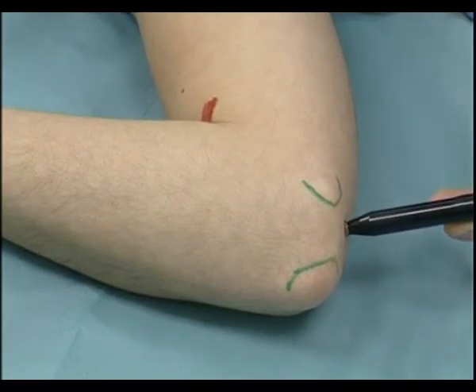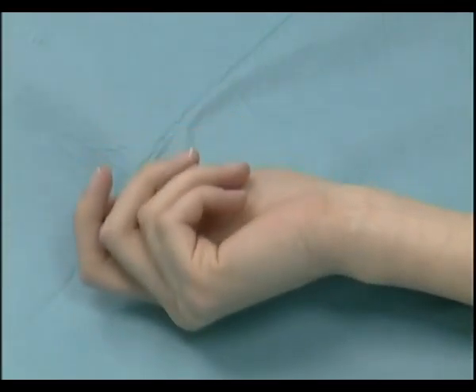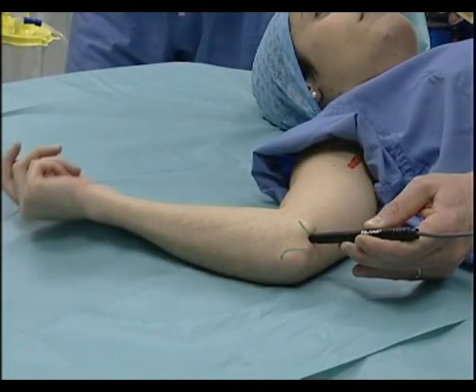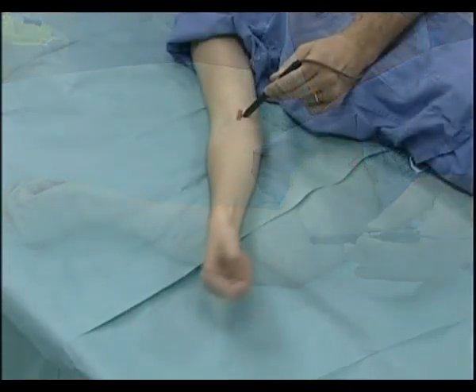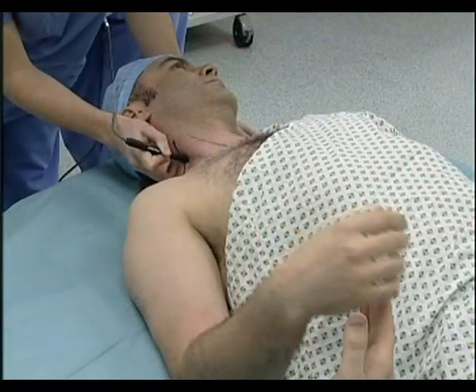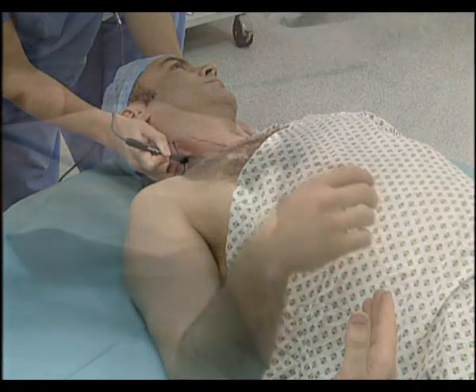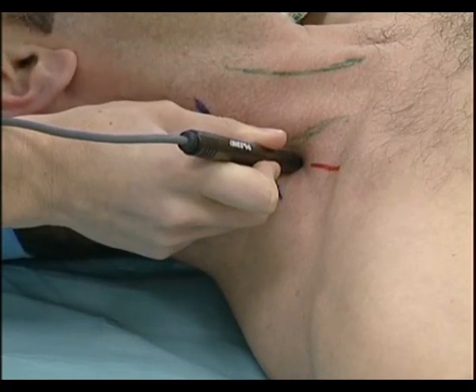Transcutaneous electrical stimulation to elicit motor or sensory response is used to assist identification on the skin for needle insertion during peripheral nerve blockade. Pre-location of the nerve could therefore be useful in reducing pain, as the procedure reduces exploration time with the needle and improves precise location of nerve position during the block. The technique allows the awake subject to experience paresthesia and motor twitch in a controlled environment. Hence the patient is aware what they will experience and is often less fearful of nerve blockade.